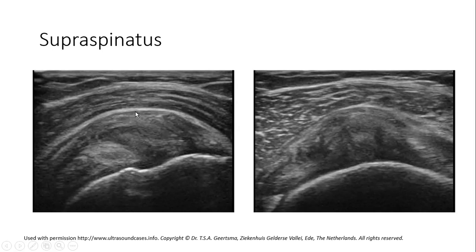You can also see the tendon appears to be thickened in this portion here. And you can confirm that in short axis, it looks swollen or enlarged. It has lost its normal fibrillar pattern, its normal tendon contour, and you can put the color Doppler here and see if there is any vascularity in this tendon or not. So I have already said all that's wrong here. Now let's try to put it together in an impression.